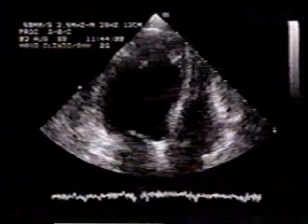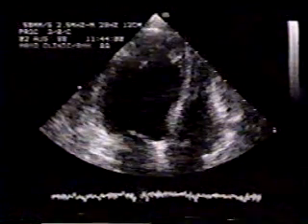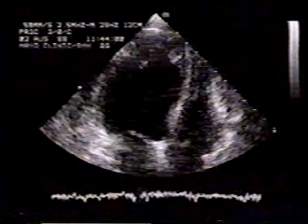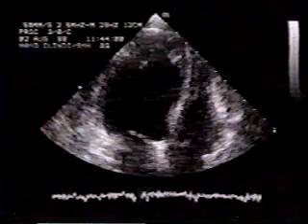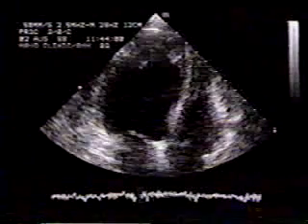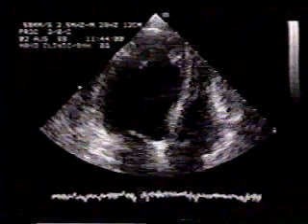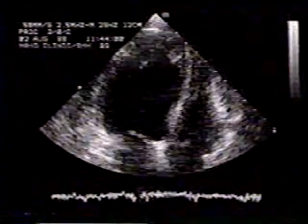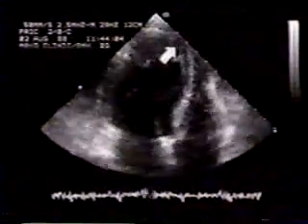Patients with acute infarction and thrombus clearly identified by echo are at significantly increased risk of embolization. We anticoagulate with heparin as soon as a thrombus is identified and place the patient on Coumadin for 4 to 6 months. This 72-year-old female presented with an acute anteroseptal apical infarct. Once more, thrombus is evident at the apex.